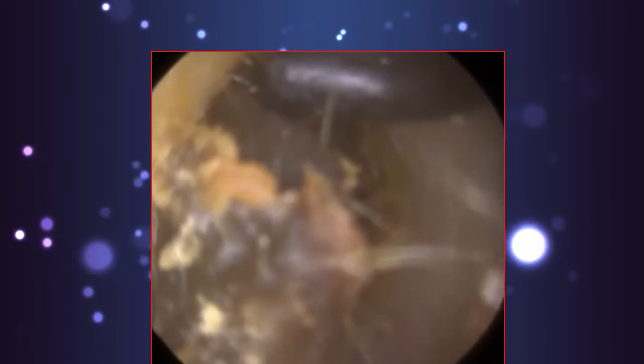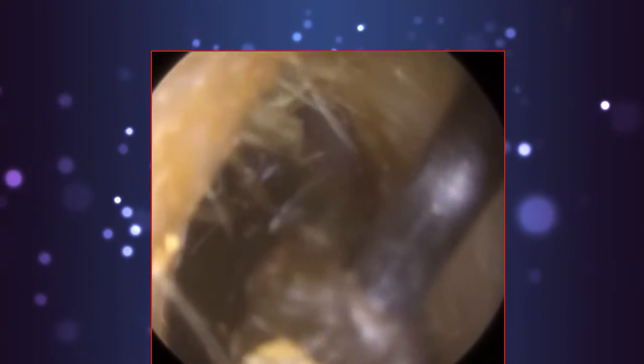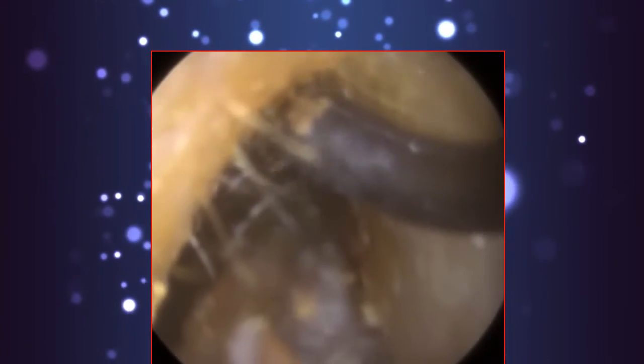So finishing with the left ear, just in the right ear, again, a really hard, dry piece of wax, dead skin. Suction wasn't going to remove that, so I've gently used an ear hook. I've prized it off the posterior canal wall, so I've loosened it. I've then embedded the tip of the hook within the core of the wax, and I'm just rotating the hook in a different direction, getting quite deep there now. Slowly but surely extracting it.